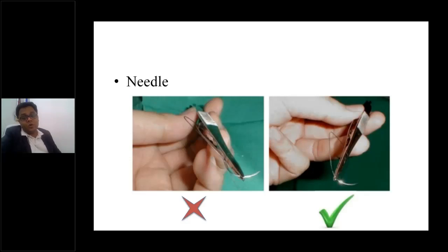Another important thing is holding a needle, a very common mistake. Our surgeons and our friends have been telling it since our internship. The needle has to be held in the correct manner as shown here, from the 2/3 and 1/3 distance. Because if you hold it in a wrong manner, it toggles while suturing the skin. And when it toggles, it can even injure you, and that will be your fault and not the fault of the needle. So if you report it, you will be considered wrong and not the instrument, because this instrument has been rightly validated and being used since eternity.